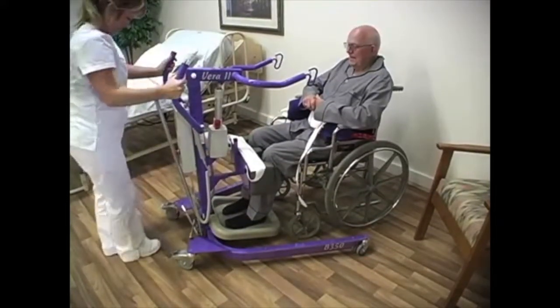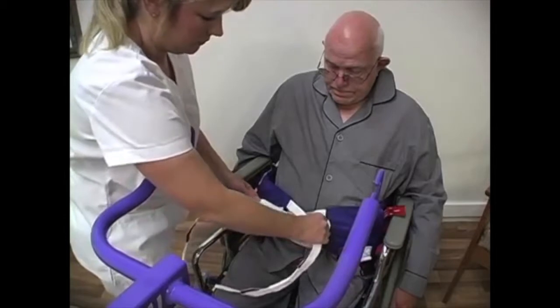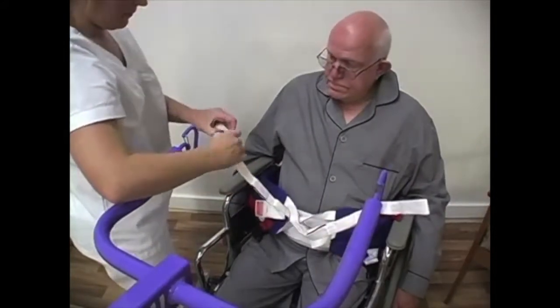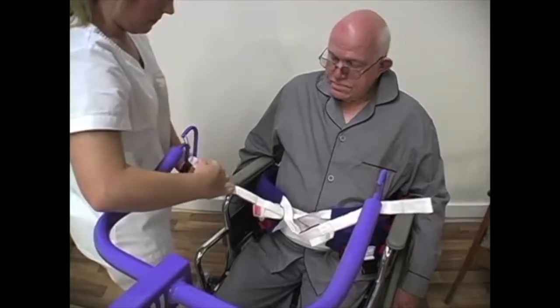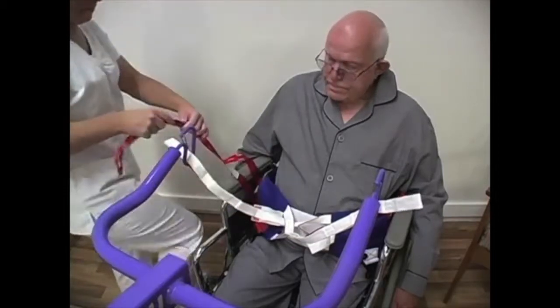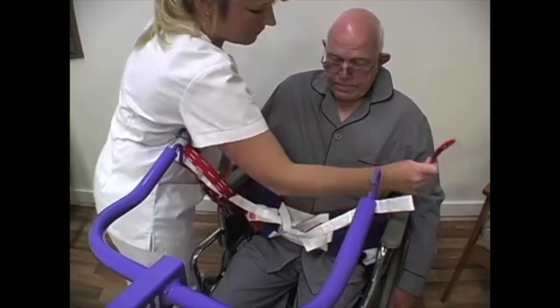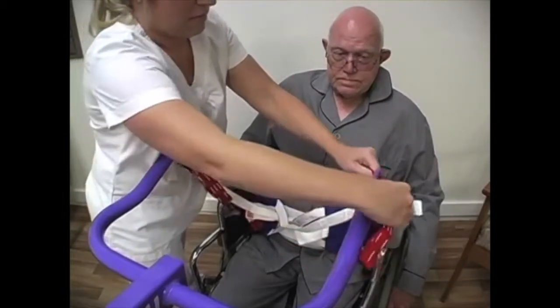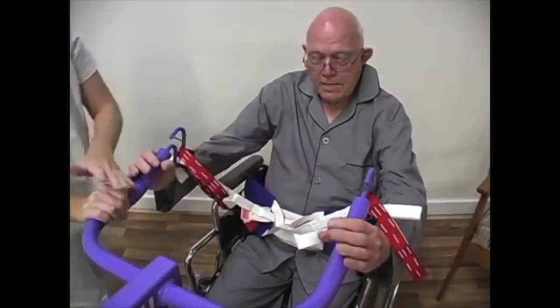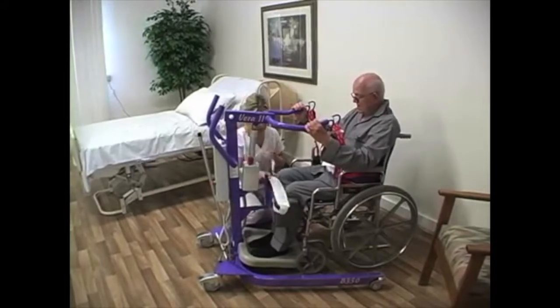Explain the procedure to the client. Lock the brakes. Cross one back belt white strap through the loop closest to the back belt on the other white strap. Connect the white strap snugly to the lift arm hooks using the same loop on both sides of the back belt as shown. Remove the colored straps from the pocket and connect the colored straps straight to the lift arm hooks using the same loop on both sides of the back belt. Assist the client to hold onto the hand grips or the colored straps when possible. Double check the back belt loop connection to the lift. Snugly fasten the knee straps behind the client's knees.